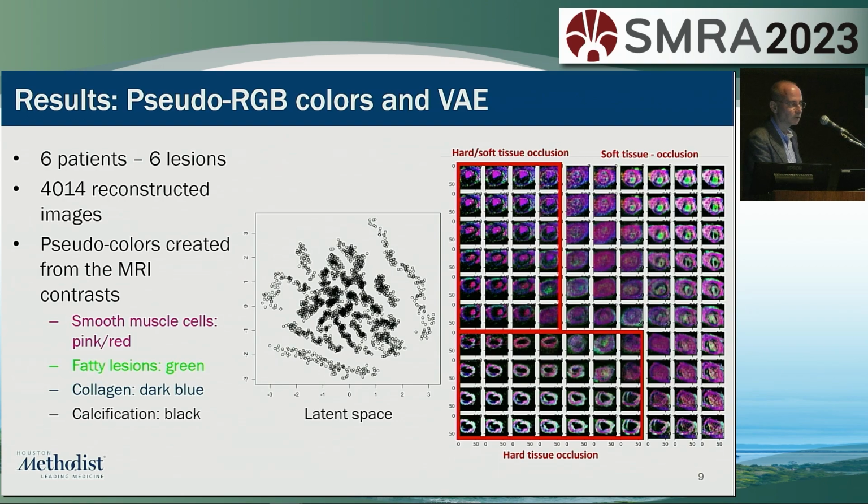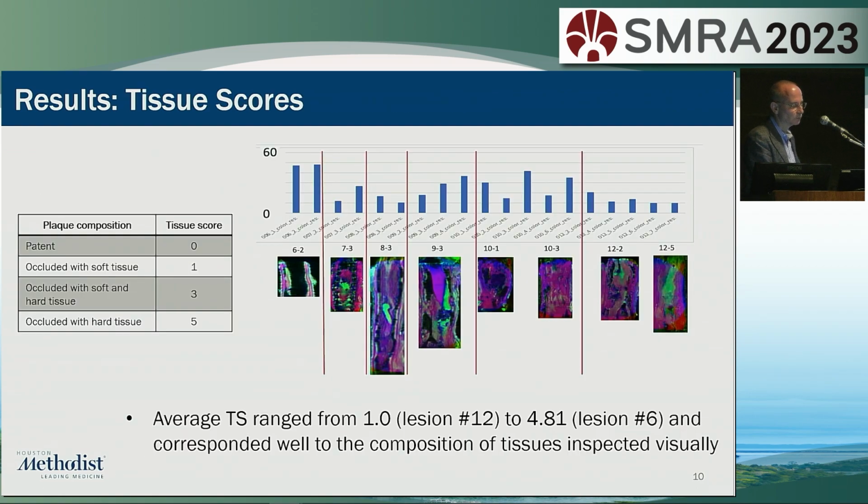So at the end of the day, we're not making a claim that we reconstruct every single component here, but we really look at hard versus soft. We are also confident staying in the two-dimensional latent space to make sure the algorithm is not overly complex. There would be going to higher dimensions, but for this particular case, we're looking at two conditions more or less. So how do you go back to that? What you could do is shown in this slide: this is the axial cross-section of each of these tissues, and the sagittal cross-section of each of these tissues.